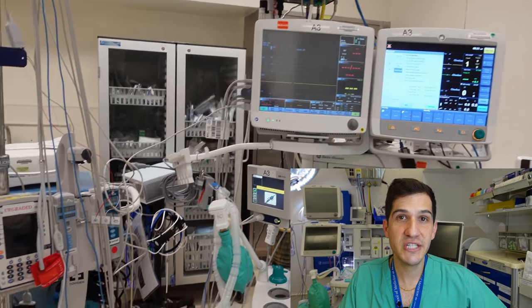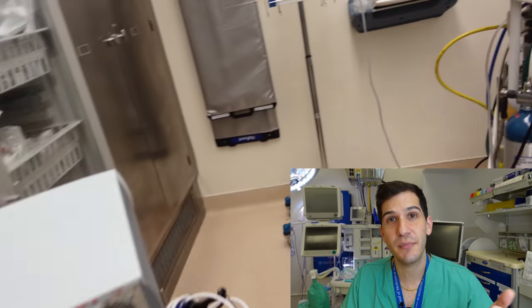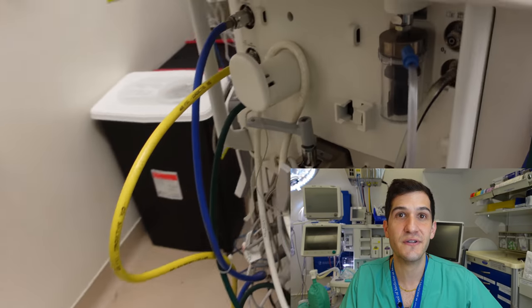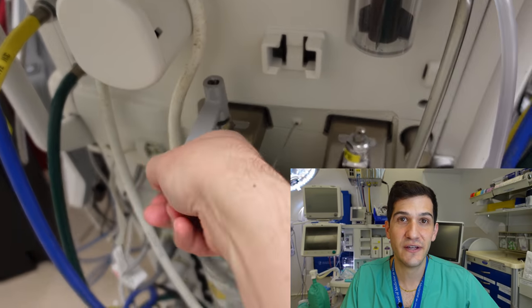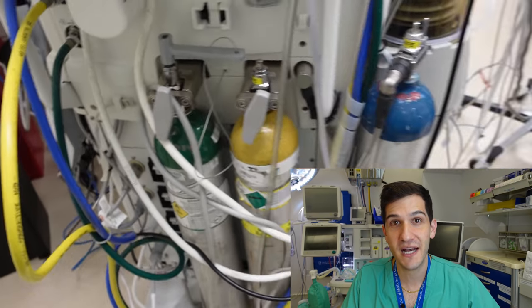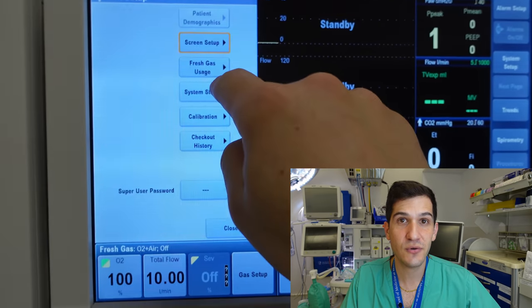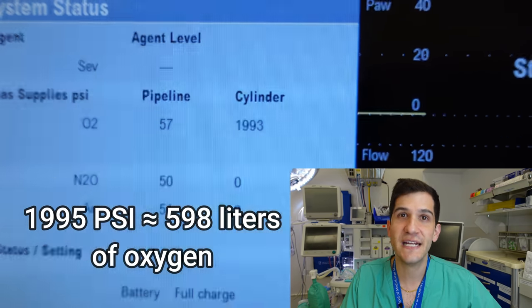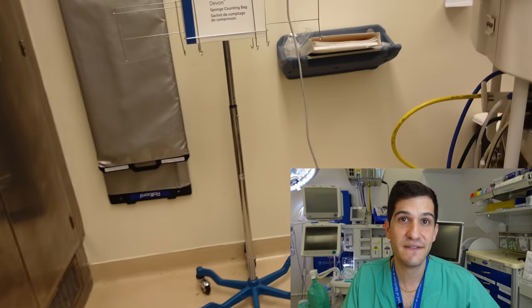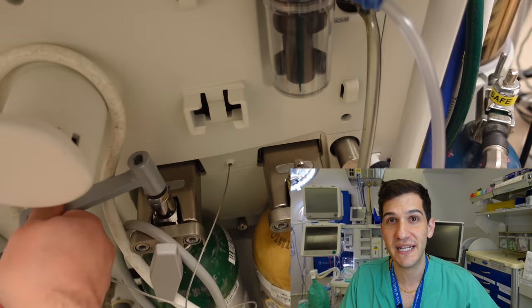The first component of my machine check is going around to the back of the machine, opening up the backup oxygen tank, and making sure that there's an adequate amount of oxygen in the event of a catastrophic failure of the oxygen supply from the main hospital system. Then I come around to the front to make sure the volume is adequate, and then go back and close the oxygen tank — because if it's left open it could leak, and then if I really needed it there wouldn't be any oxygen left.